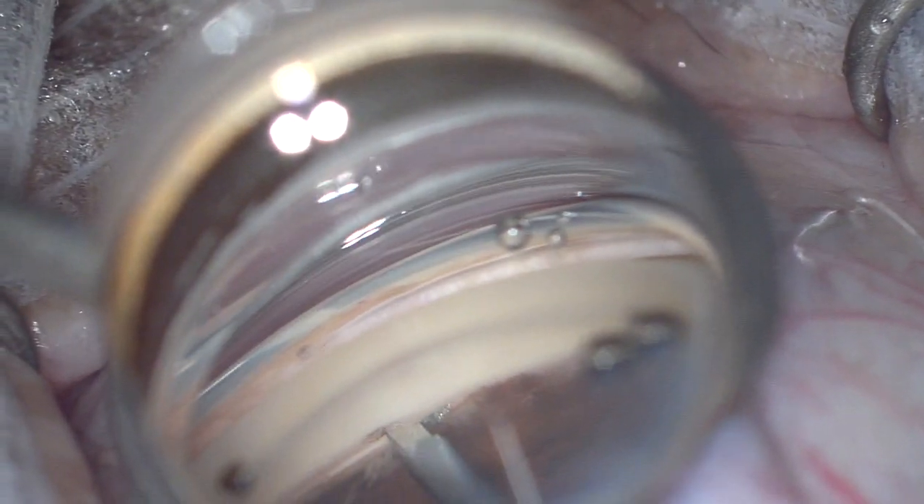Here we see the Cahook dual blade — it incises through the trabecular meshwork, exposes Schlemm's canal, and it does this by removing a strip of the trabecular meshwork.